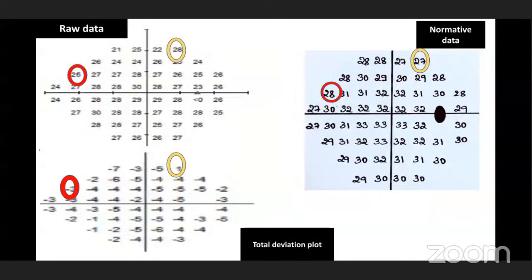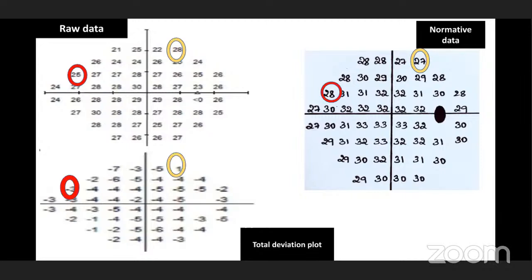Here is an example for the total deviation plot. If the normative data value is 27 and the raw data value is 28, the deviation plot shows plus 1 — meaning the retinal sensitivity is above the normative data, indicating more sensitivity than normal.